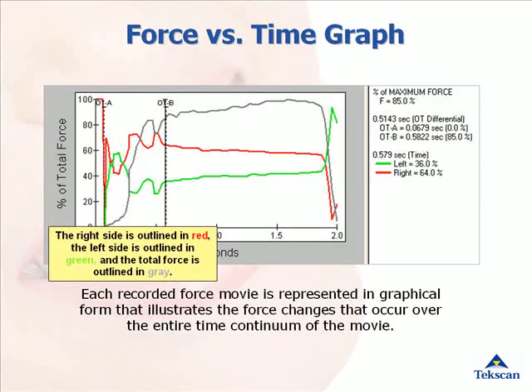Each T-Scan recording gives you a force versus time graph. The gray line represents the maximum force percentage. The black vertical line shows you where you are in time for that recording. The red line represents the percentage of total force on the right side, and the green line represents the percentage of total force on the left side of the arch. The OT-A and OT-B lines allow for time calculation, measuring the time between two points — for example, how long did it take for this patient to occlude.